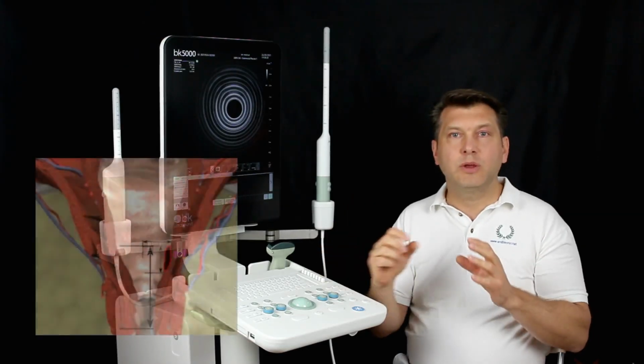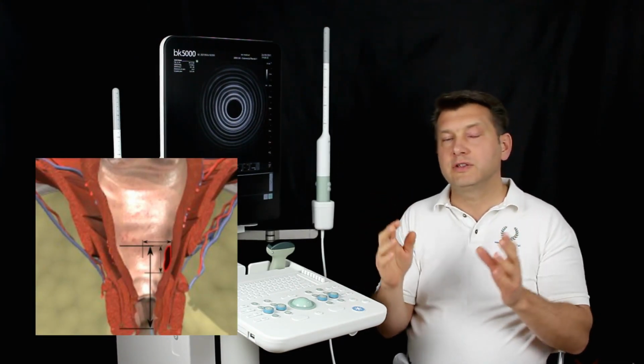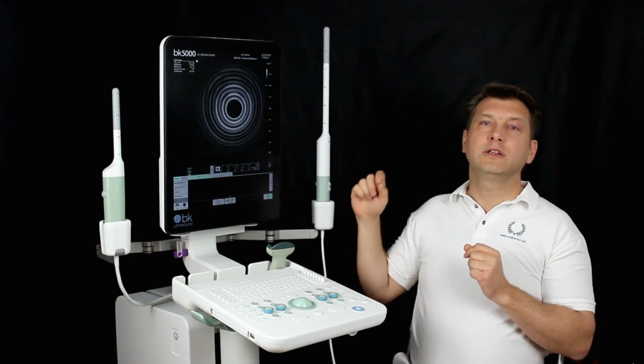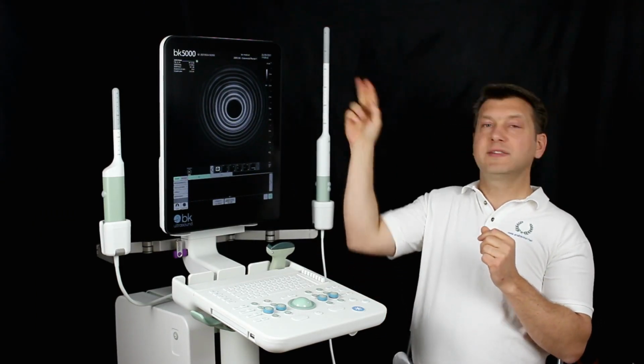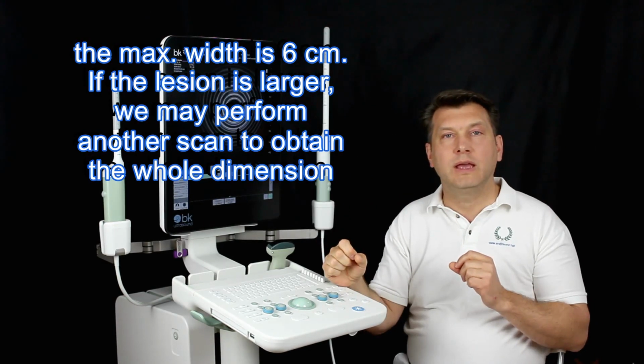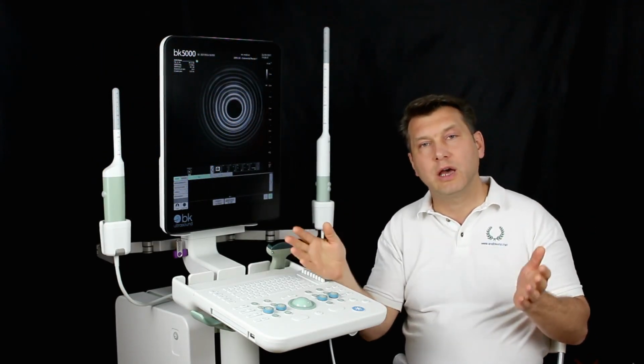The width. The width should be chosen in such a way that the entire lesion is obtained. It is crucial to know that our probes have a maximum of 6 cm ultrasound detecting range. If the lesion is bigger, the examination must be performed several times.